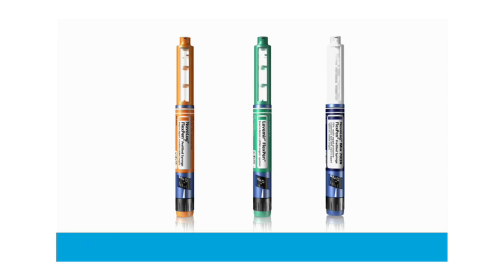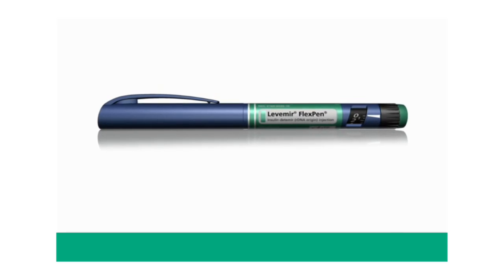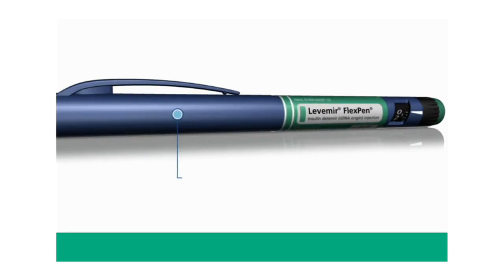Please select an insulin for your FlexPen demonstration. There are eight key parts of Levemir FlexPen.